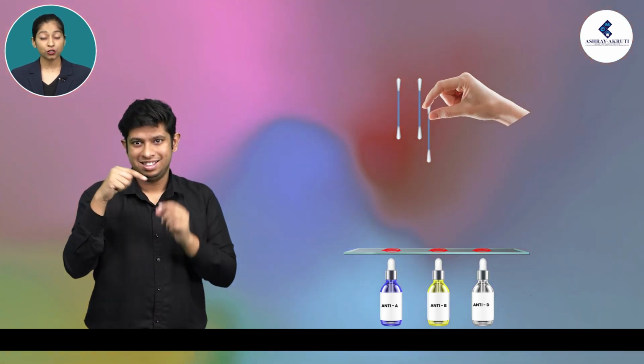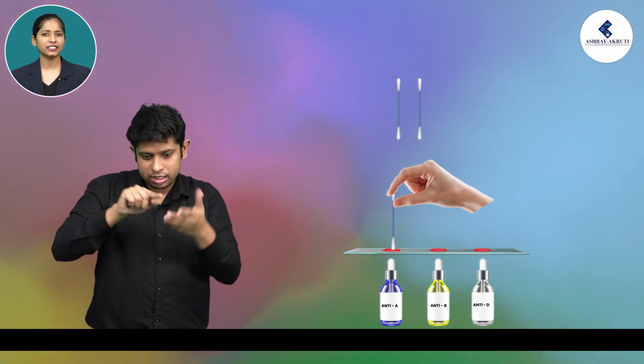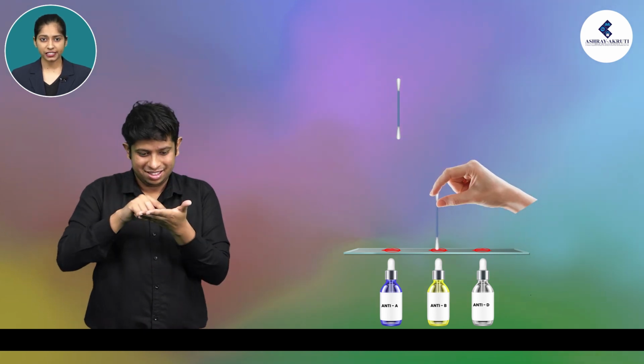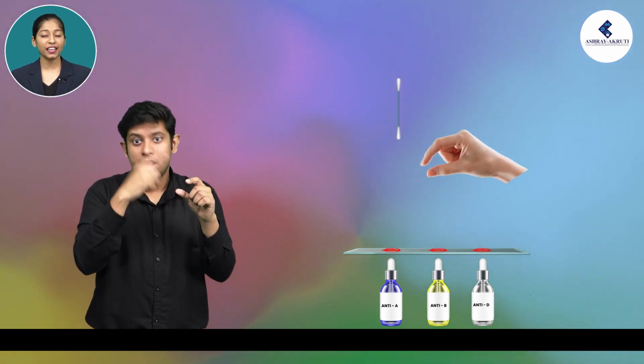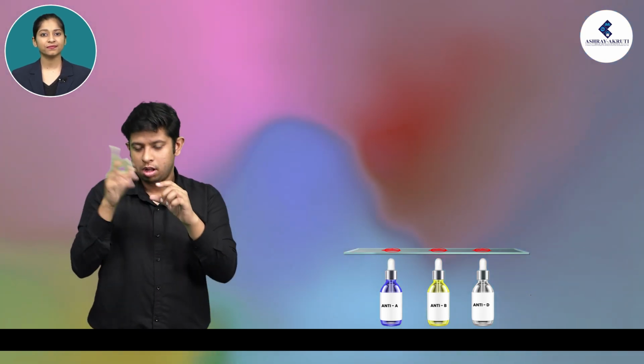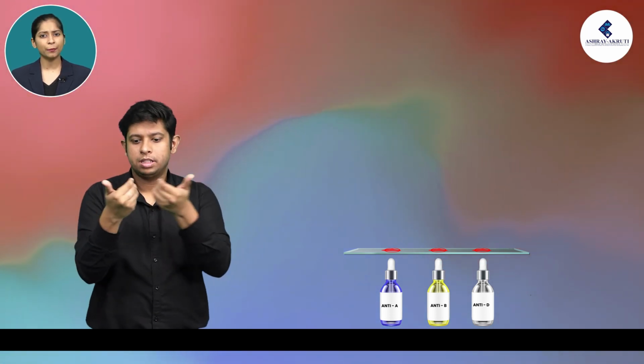Use a toothpick to mix the blood and antiserum and stir gently. Do it for each of the circles using a fresh toothpick every time. The wax pencil circle will help to keep the sample isolated.